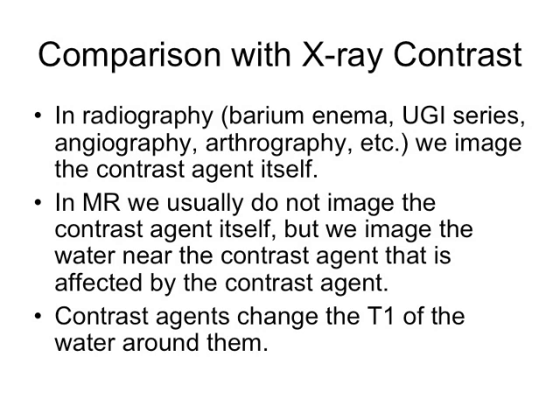What we're capturing is the effect that liquid had on the surrounding tissue and how it changed its magnetic susceptibility. When the tissue's magnetic susceptibility has been changed, it will respond differently to the pulse sequence as compared to the other tissue, the non-enhanced tissue. It's those changes that we capture on our MR images.